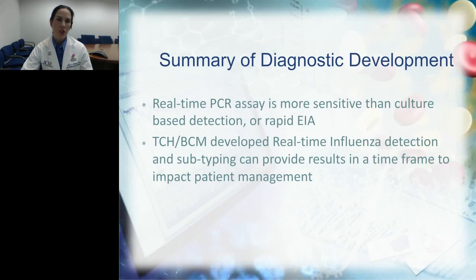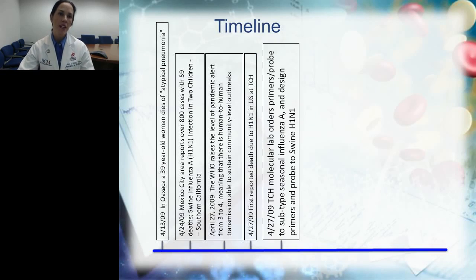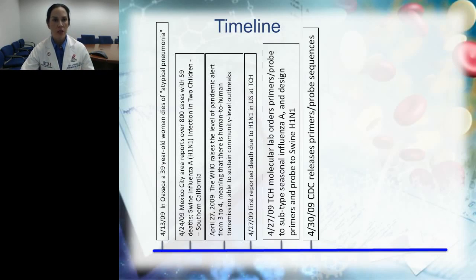So this is back to our timeline. The day we lost that patient, we ordered our primers and probes and started our validation. And it was 3 days later that the CDC finally released their primers and probes, but we were all well underway in terms of testing and validating our assay, so we decided to go forward with our homebrew assay.